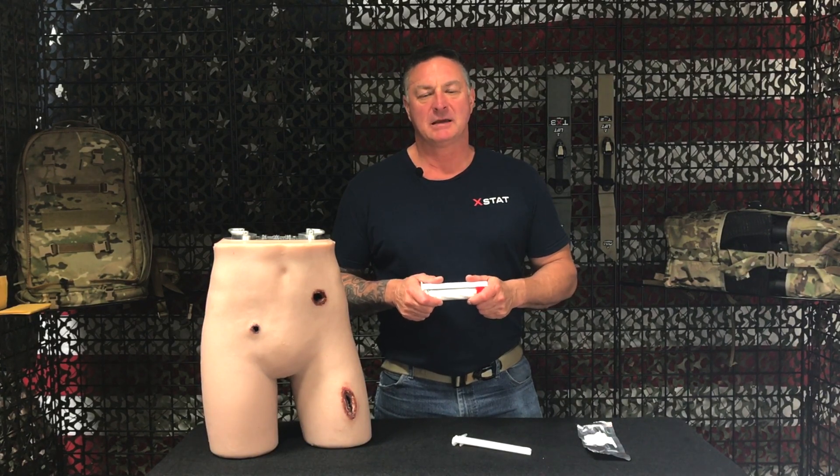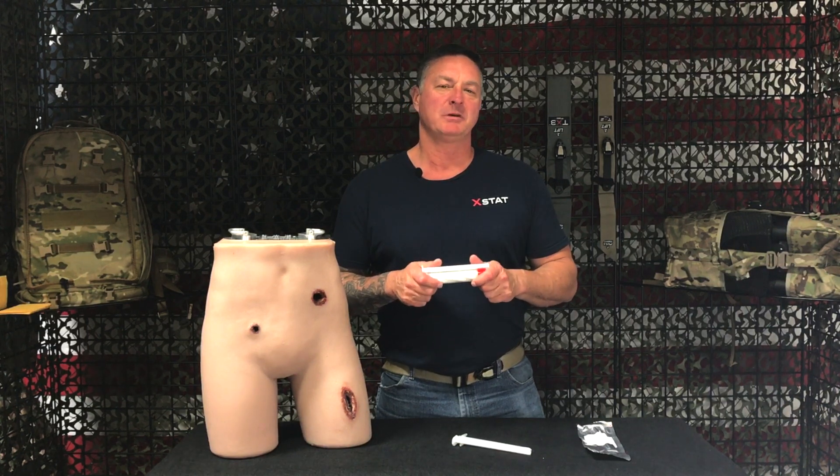Hi, this is John from RevMedx. Today we'll be discussing XSTAT, an injectable hemostatic agent for the treatment of penetrating wounds.